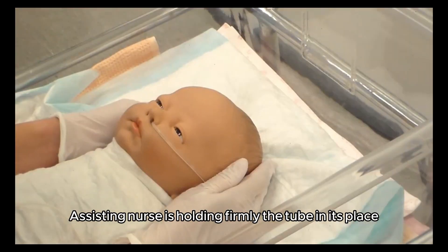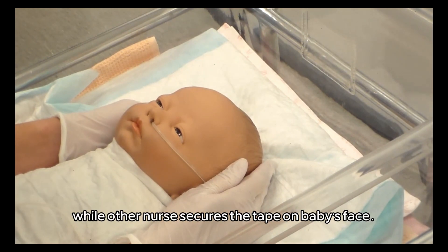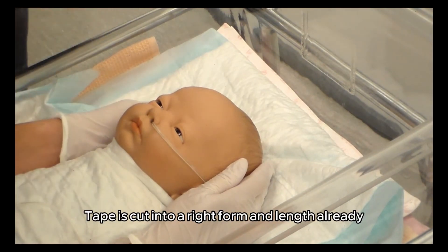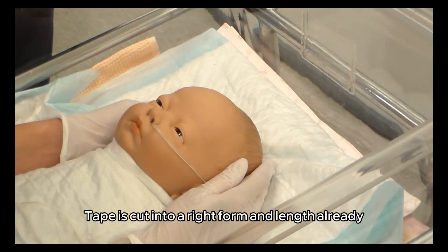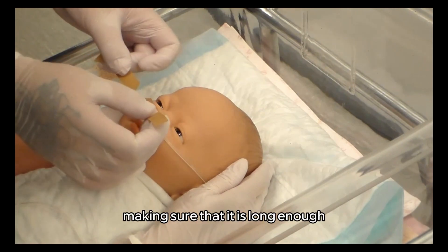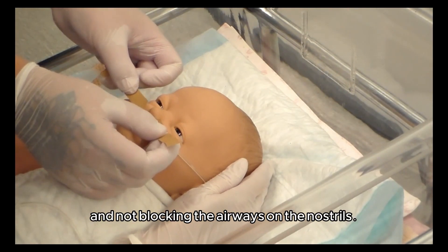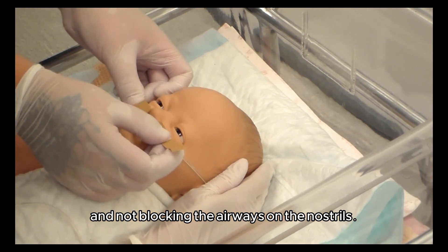The assisting nurse holds the tube firmly in its place while the other nurse secures the tape on the baby's face. The tape is cut into the right form and length prior to the procedure, making sure that it is long enough and not blocking the airways at the nostrils.